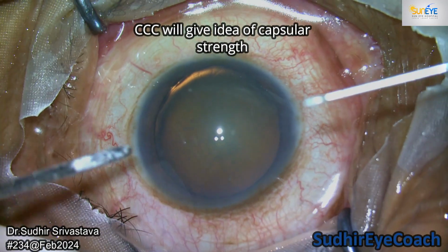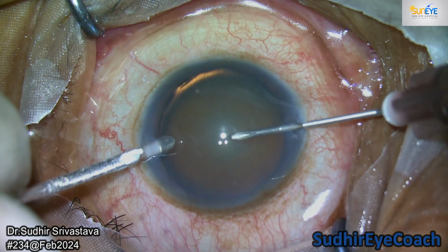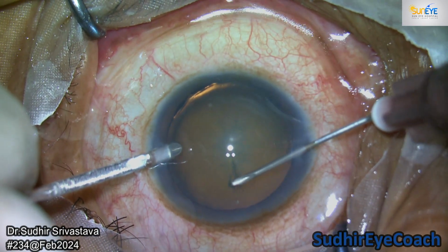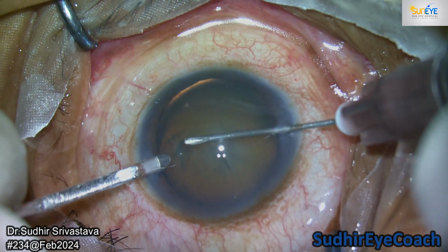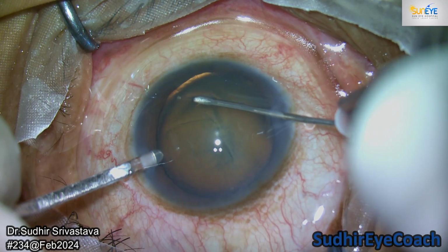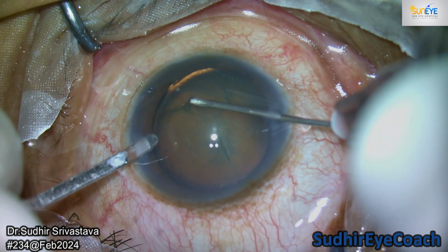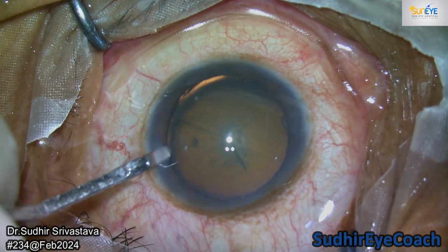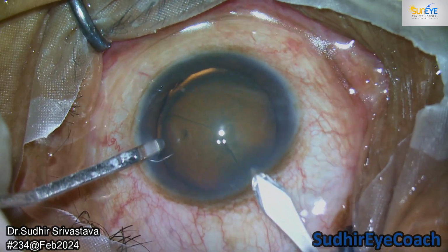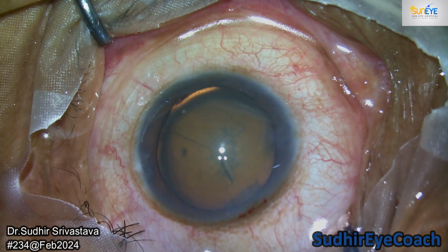Today I am here with phacoemulsification, in which a large area of subluxation was found. I created two side ports and filled the chamber with viscoelastic, and during the propagation of capsulorhexis you can be well aware of the weakness of the capsular pull and the area of capsular dehiscence.